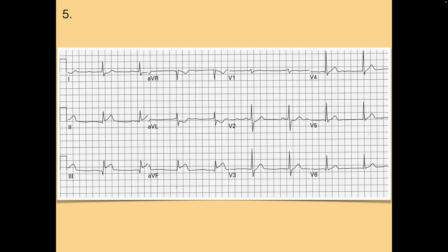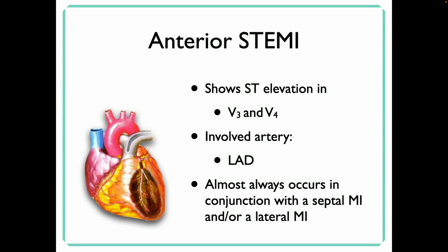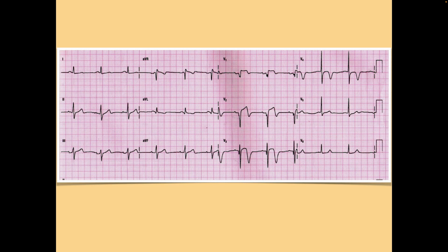And then we're going to go back because I somehow have been a little confused this whole lecture about what, we actually did not talk about this one. So who's next in line there? Okay, Grace, can you see it from here? You don't have it on your handout. Not this one. This was one that just came before that got lost in the shuffle. See some there? Uh-huh. And I would put the J point right there.